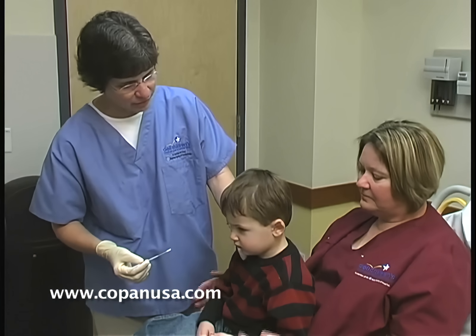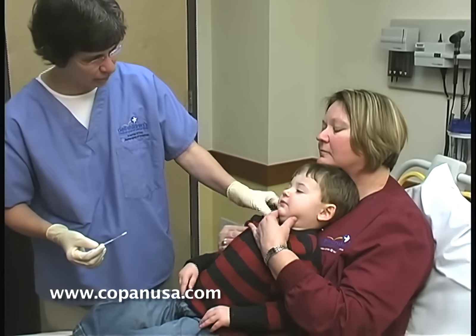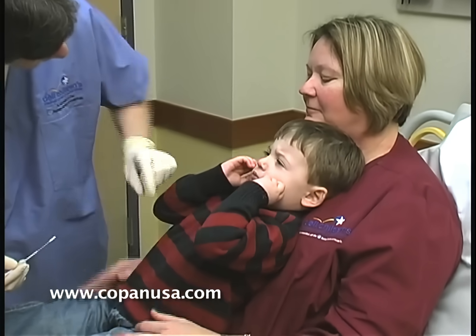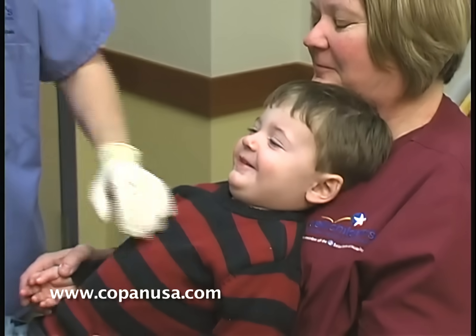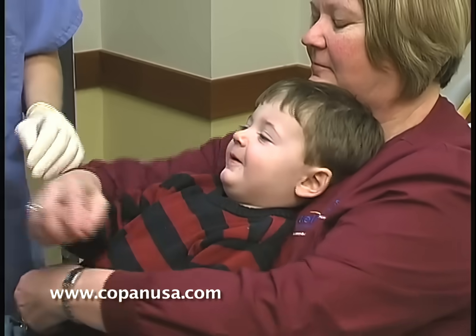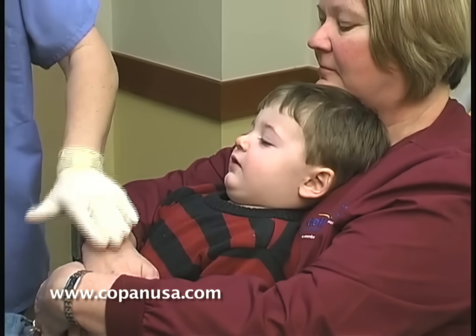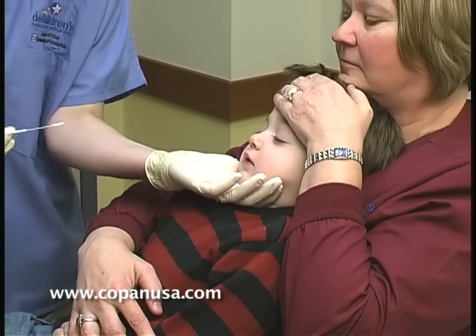What I do is have the patient lay back against the person who's helping — just rest their head back like that. Then I have the parent or guardian hold their hands and then put their other hand on the forehead.